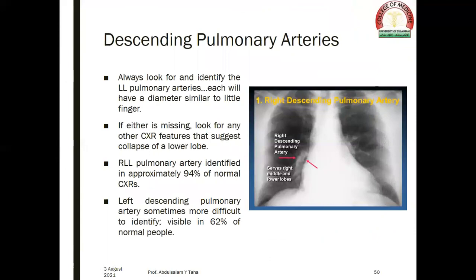The descending pulmonary arteries or lower lobe pulmonary arteries: always look for and identify the lower lobe pulmonary arteries — each will have a diameter similar to a little finger. If either is missing, look for other chest x-ray features suggesting collapse of the lower lobe. The right lower lobe pulmonary artery is identified in approximately 94% of normal chest x-rays, while the left descending pulmonary artery is visible in only 62% of normal people. On this chest x-ray we can see the right descending pulmonary artery, which is a normal finding.